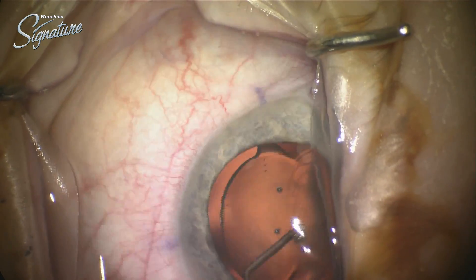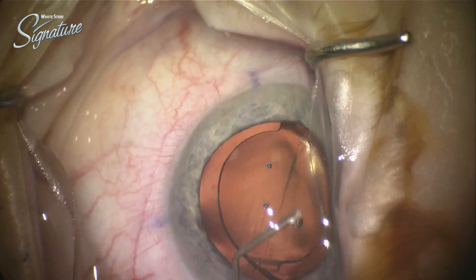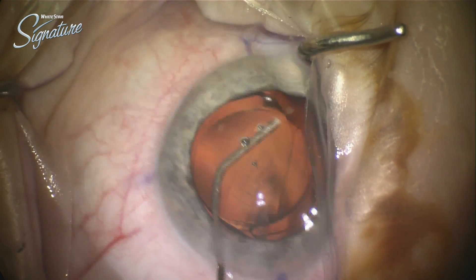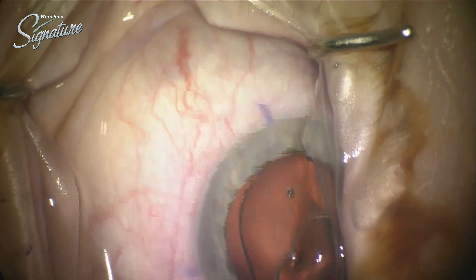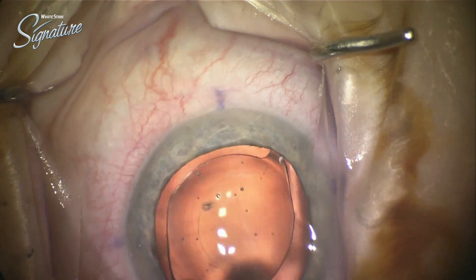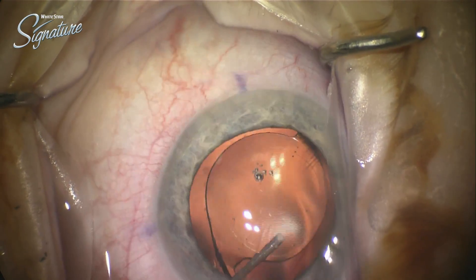Here I am using BSS on a 5cc syringe, basically inflating the anterior segment as I go, manipulating the lens back and forth. There really isn't much fibrosis to the capsule, there really isn't much regenerated material. It really is coming pretty free and pretty easy and pretty loose, so it really wasn't too surprising that it had rotated.